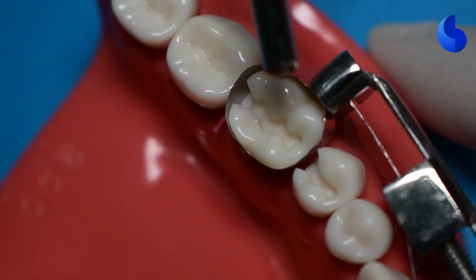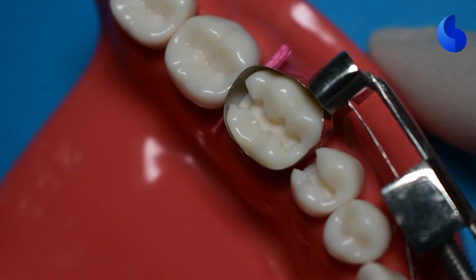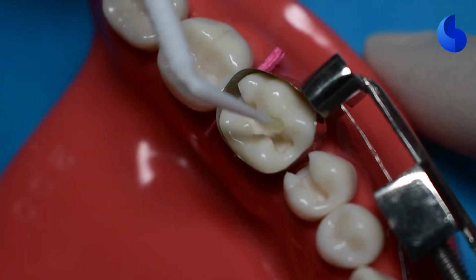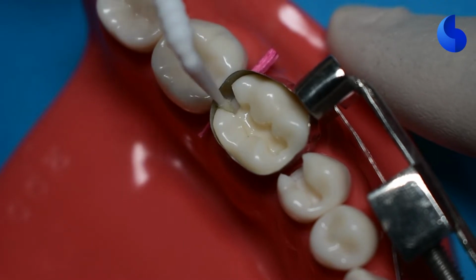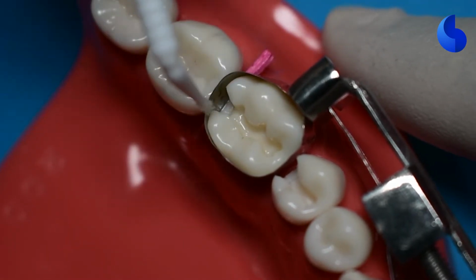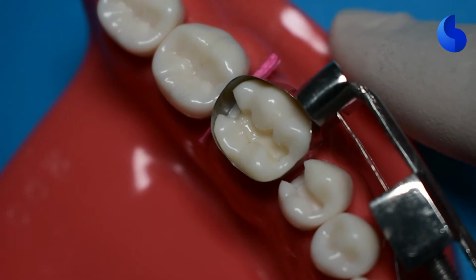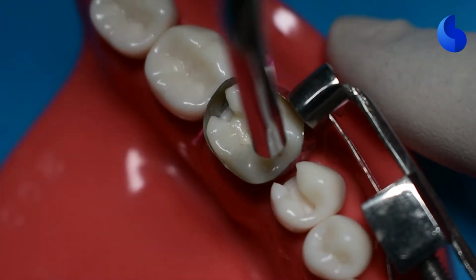In this video, we'll look at a class 2 composite mandibular molar restoration on tooth number 19. So the first thing you need to do is to isolate the tooth, replace the missing wall with your matrix band so that you can use it with a Tofflemire retainer, or you can use a segmented matrix, whatever system you're comfortable with, and then use a wedge right at the cervical area so that there is no overhang.